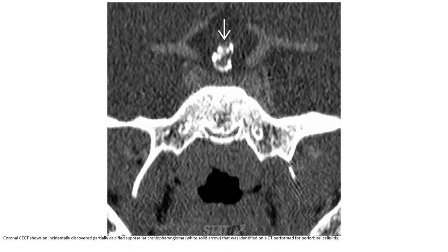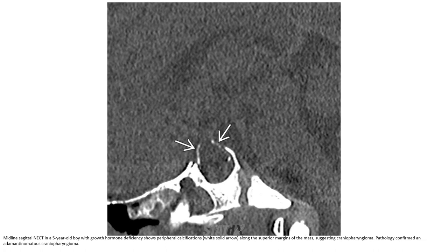Contrast-enhanced CT shows an incidentally discovered partially calcified suprasellar craniopharyngioma identified on a CT performed for sinusitis. Mid-line sagittal non-contrast CT in a child with growth hormone deficiency shows superior peripheral calcification along the superior margin of the mass, suggesting craniopharyngioma. Pathology confirmed adamantinomatous craniopharyngioma.